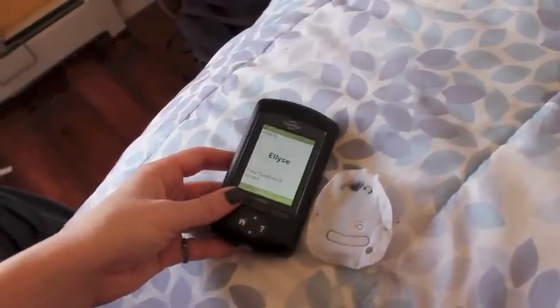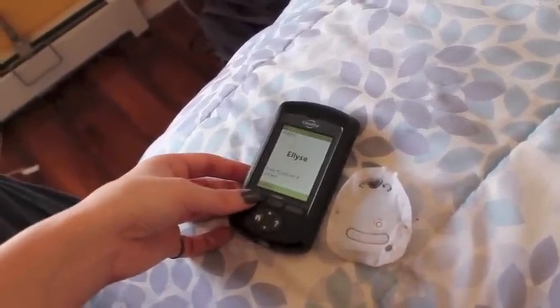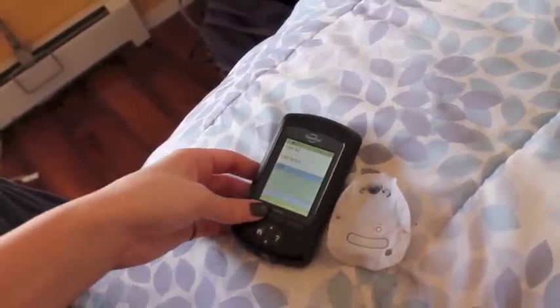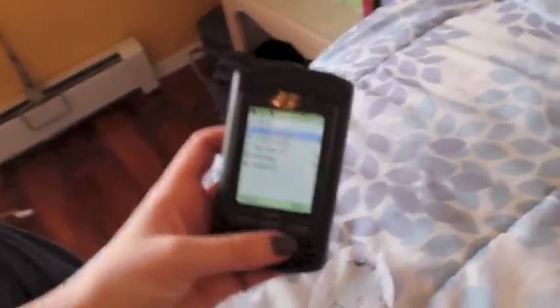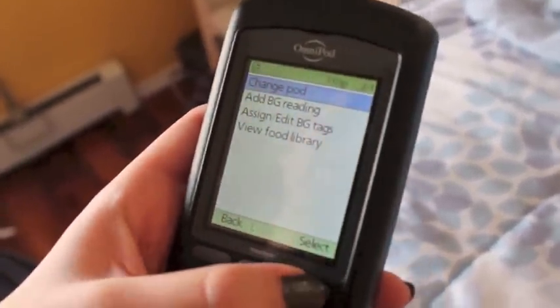The next thing you need to do is deactivate the pod, which actually most people do while it's still on their body, but I do it either way just because it doesn't really matter much. So I just went ahead and took it off because I like to get that part over with. So you're gonna go into the More Actions section of your Omnipod or your PDM, and you're gonna tell it that you want to change your pod.